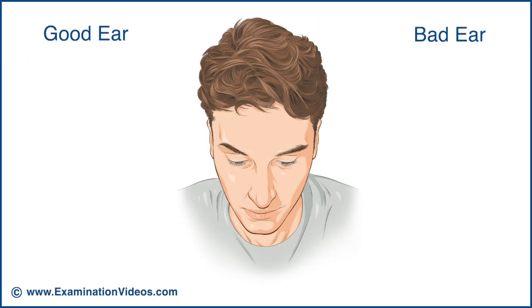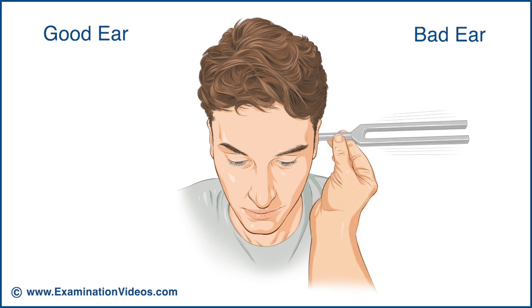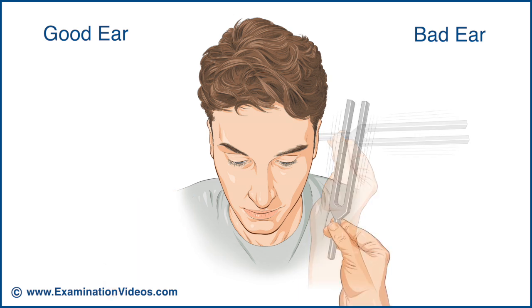To explain the Rinne test, an example of a patient with a hearing loss in the left ear will be used. Strike a 512 Hz tuning fork and place its handle on the left mastoid process. Ask the patient to report when they can no longer hear the sound. At that moment, place the still vibrating end of the tuning fork near the patient's left ear and ask them if they can hear the sound again.